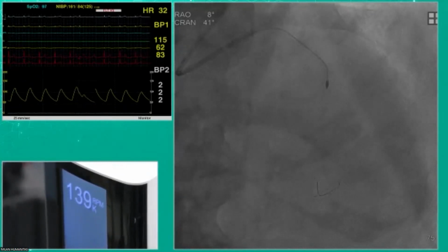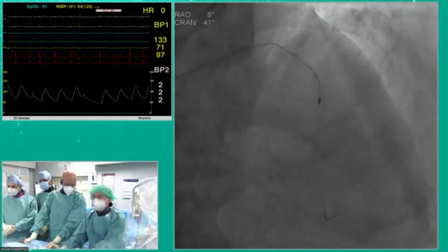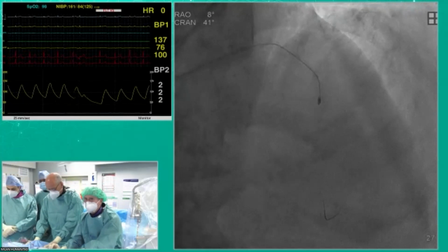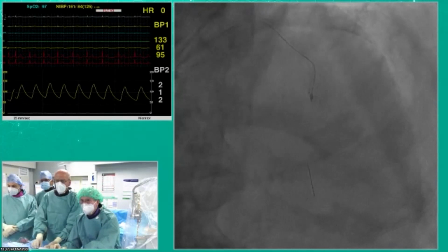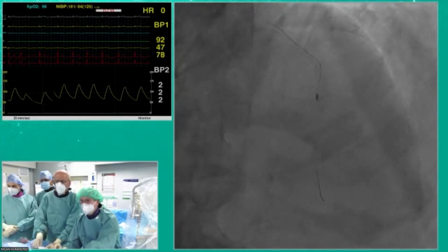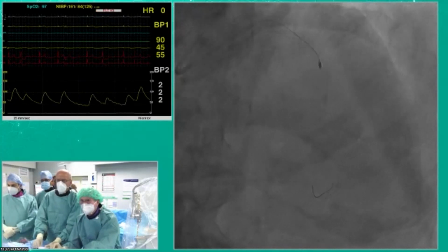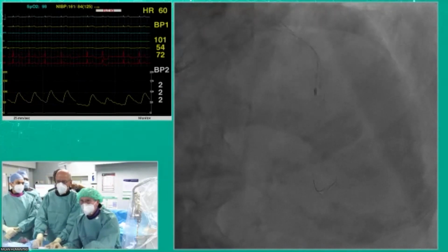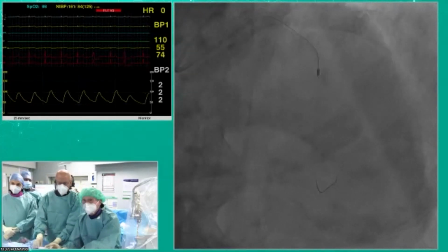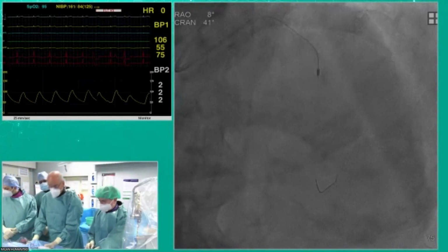Let him rest a little bit. 24 seconds. We have Roberta, the nurse. She tells us exactly after 30 seconds, stop a little. So here the discussion can be 1.5 or 1.25 as a burr, because it was quite a tight vessel. We have a little bit the idea. If 1.5 does not go, you use 1.25. But then you will use 1.5 anyhow. So if you start with 1.5, you may save some money for one burr.